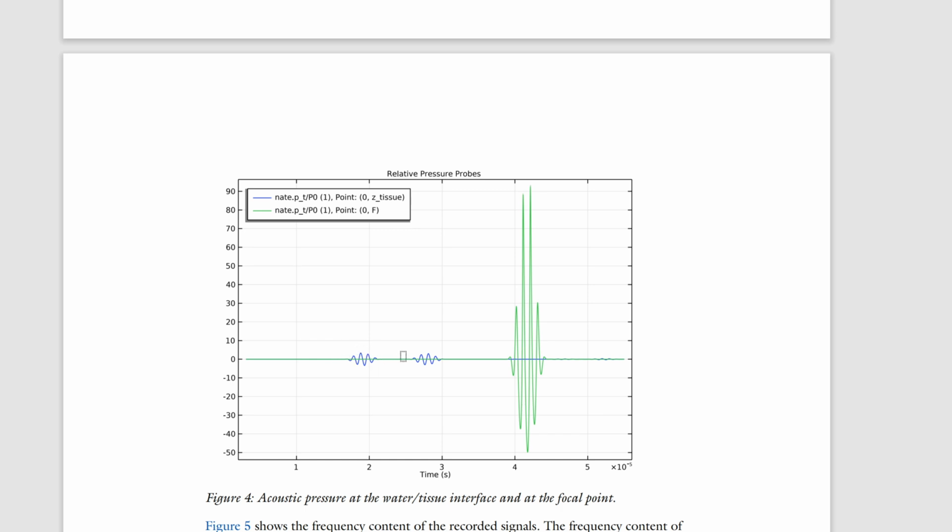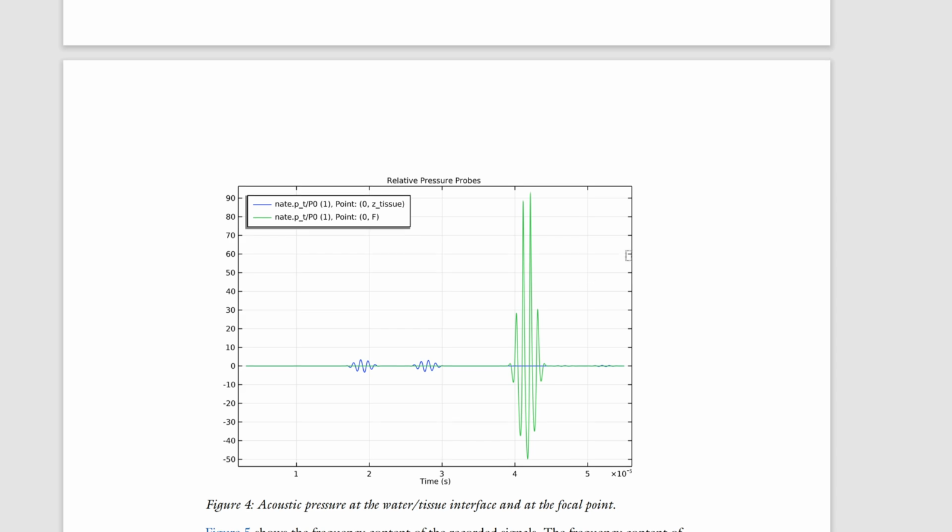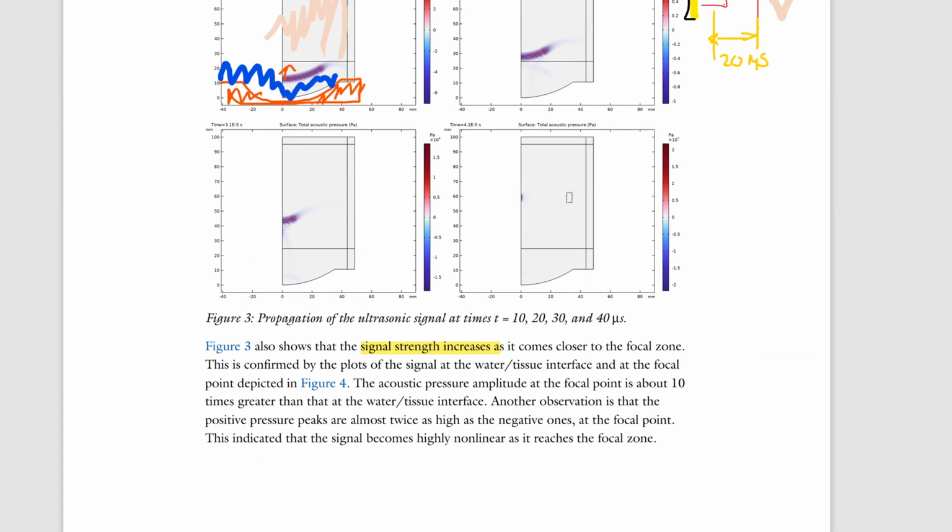Why is it blue? Tissue. Oh, they're just saying that. They're saying this is the tissue? Z of tissue. Z must be the tissue interface. Is there another one? No. I'm assuming we're at the tissue interface here, tissue interface here, tissue interface here. Tissue interface is getting less pressure, but then our focal point has very high pressure. So this is focusing, non-focused. Focusing, non-focused. So if we would see this being higher.